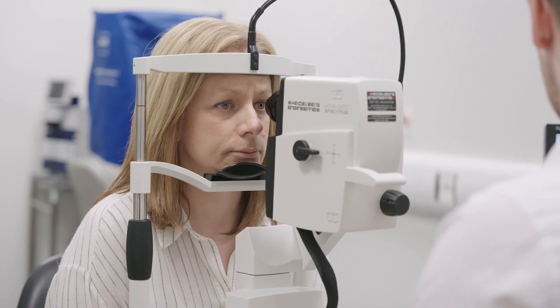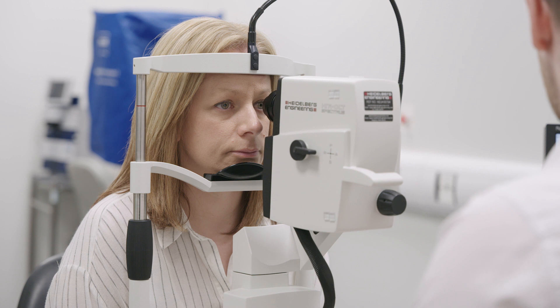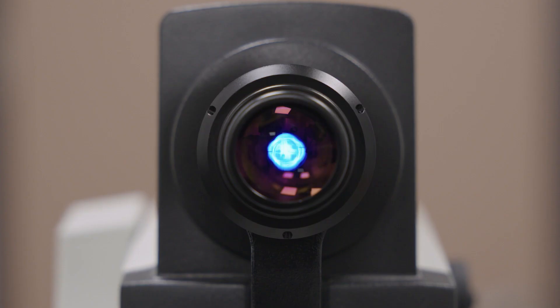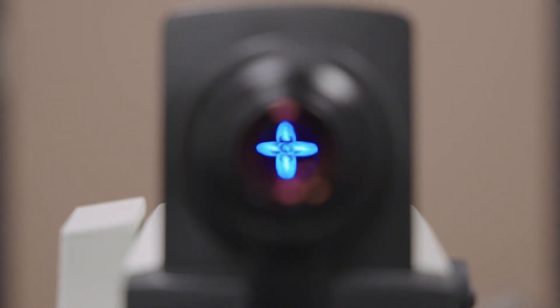When using the internal fixation target, the patient should fix on the target with the eye under examination. The target position will automatically be adjusted depending on the protocol selected.